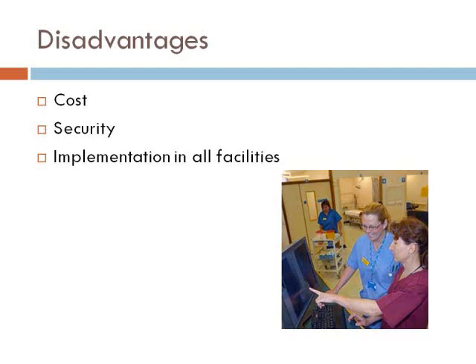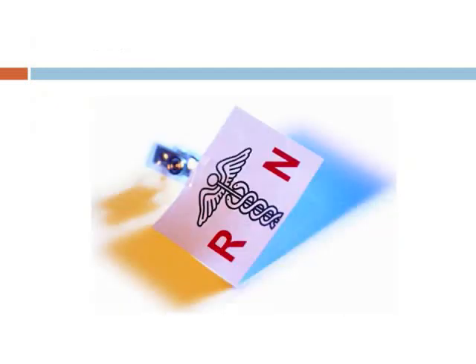So they would still need a copy of, like, the hard copy perhaps, or a copy of the images on a CD, which is possible with PACS. They can download the image to a CD and give it to their physician. But instead, the physician and the local offices could have had faster access if they had a PACS system in place, or vice versa for hospitals as well. And those are just some of the few disadvantages.